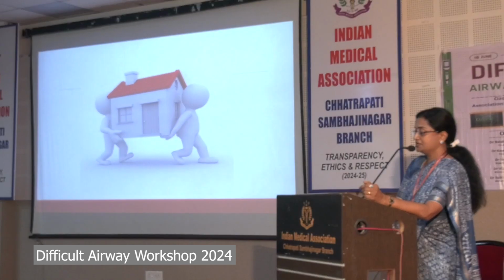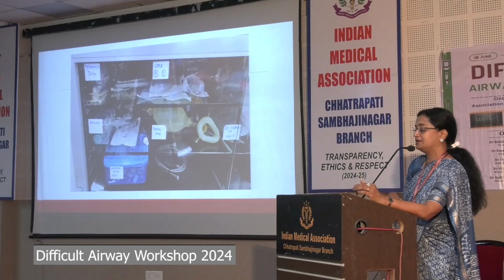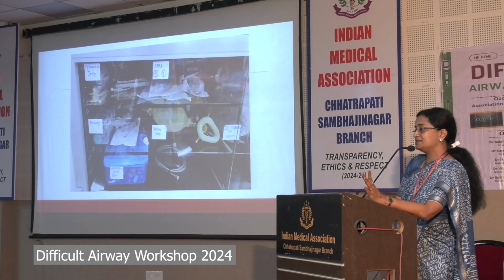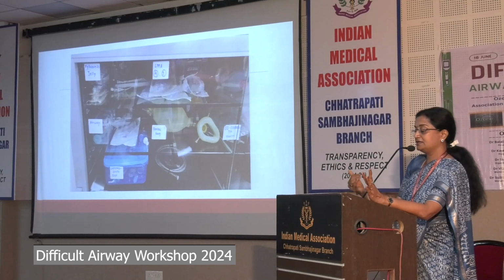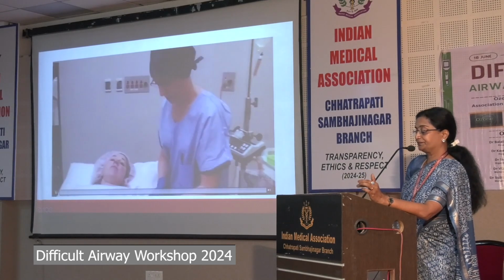Now, what is the take-home message? Almost all the OTs, when they begin, have things nicely labeled, but is this useful for us? No, there is a lot of chaos when things go wrong. I'll just show this small video.